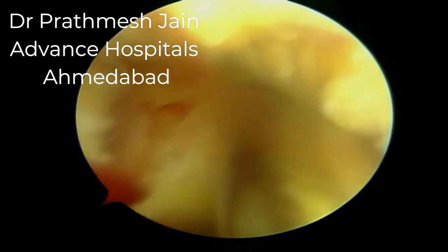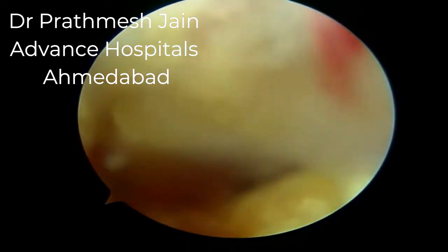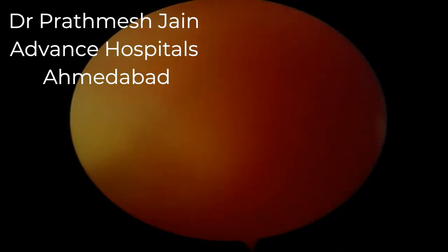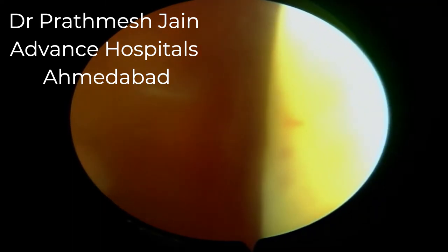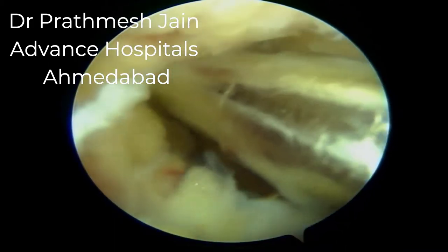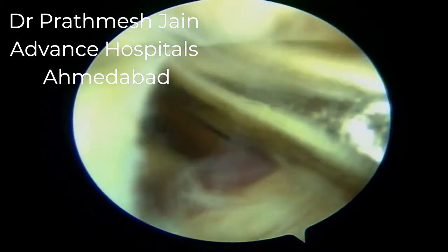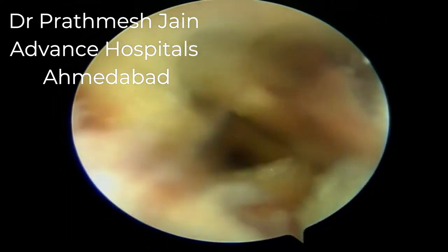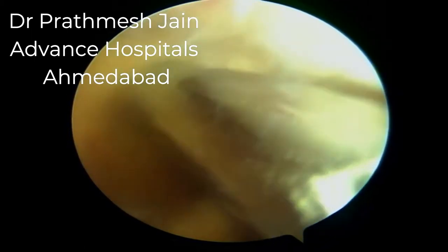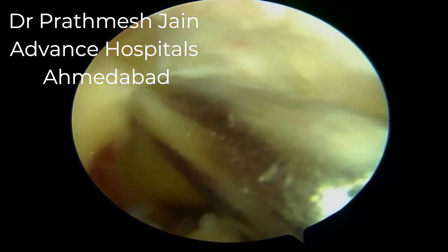We are making a window on the top of the PCL ligament. The purpose of this technique is to approach the PCL both superiorly and inferiorly through the posterior medial compartment. It is imperative to release the posterior intermuscular septum thoroughly, as this not only facilitates exposure and the surgical technique but also makes the surgery safer.